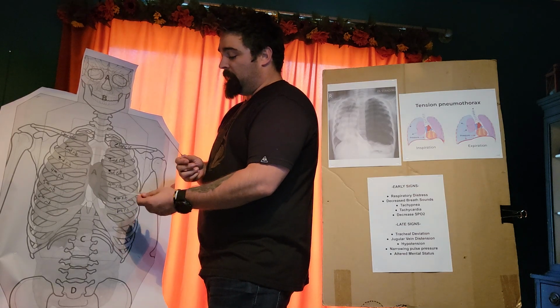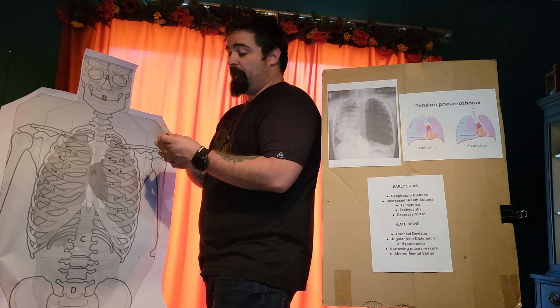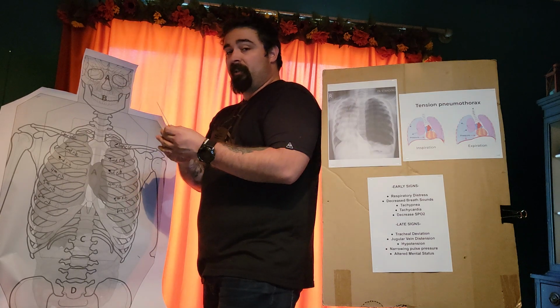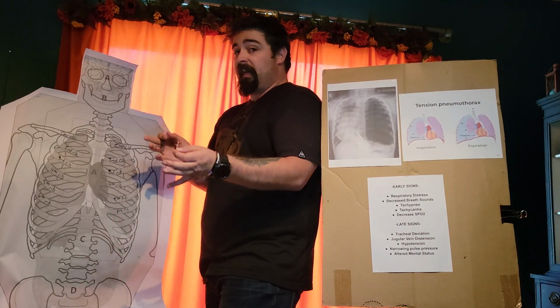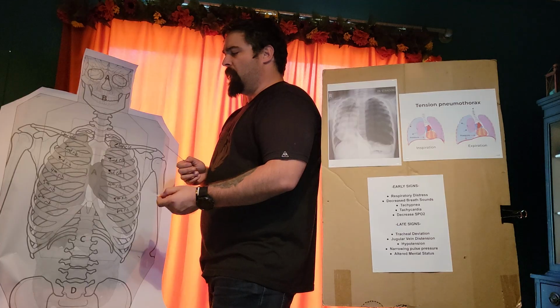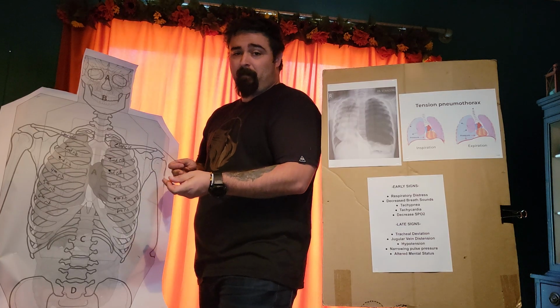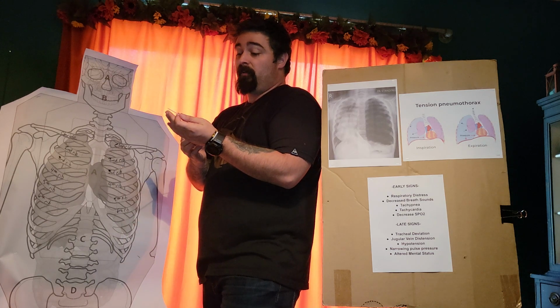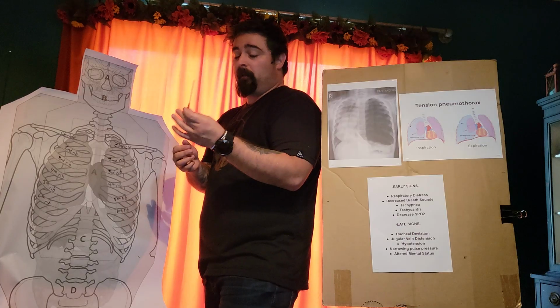Something that can be done too, instead of securing this, it can be used just as you've seen as I removed the catheter. I have the needle safely done. If you're running out of needles, or if you have a lot of patients, say it's a mass casualty, you can safely resheath these and use them again.